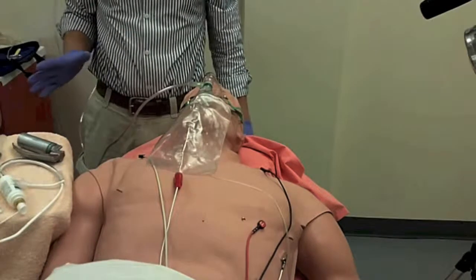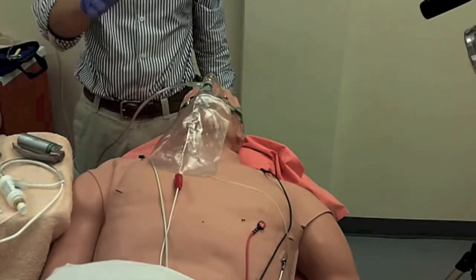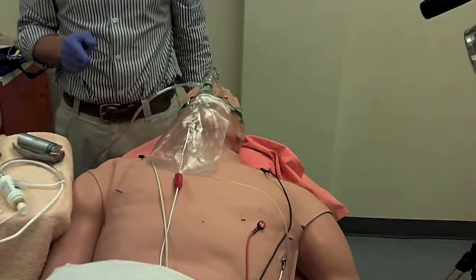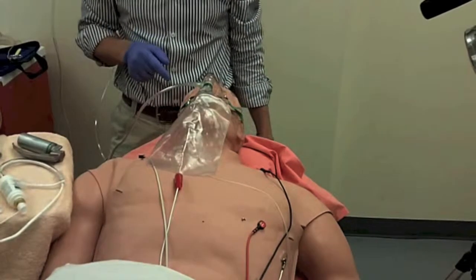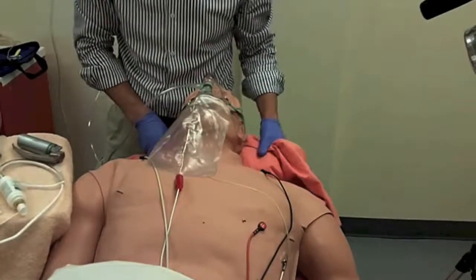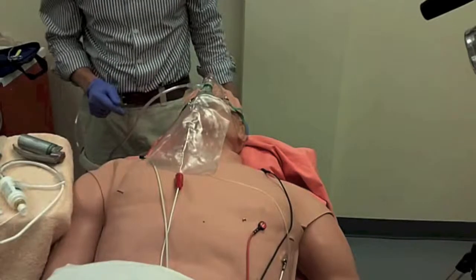Okay, Percy, so we're all set up for intubation here. The patient's vital signs are okay. Blood pressure is good. Saturation is good. We're at 100%. We've been pre-oxygenating the patient already. I think we've got everything set up for rapid sequence intubation.